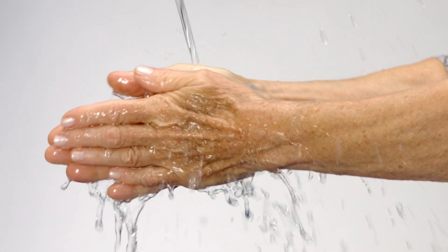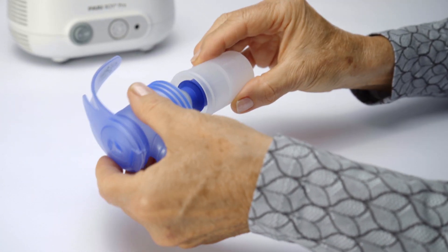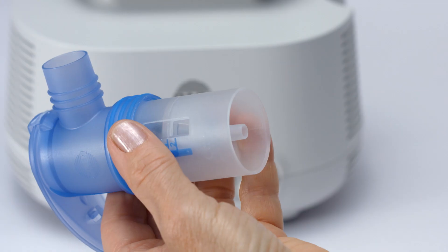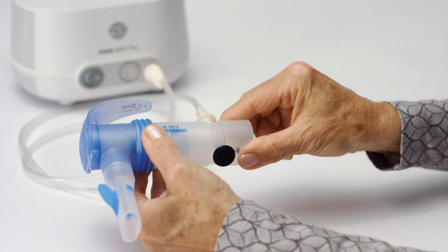Wash your hands thoroughly before each inhalation session. Assemble the parts of the nebulizer with the preferred nozzle insert. Connect the nebulizer and compressor with the connection tubing. Attach the mouthpiece and if necessary the interrupter.